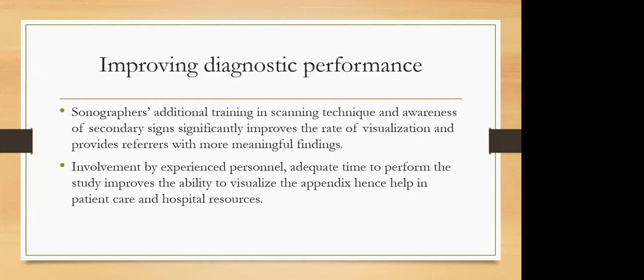The referrer needs meaningful findings, not just a vague report. Involvement of experienced personnel and adequate time to perform the study improve the ability to visualize the appendix, hence helping patient care and hospital resources. If you take your time to find the appendix, sometimes you may see only part of it and can't see the other part.